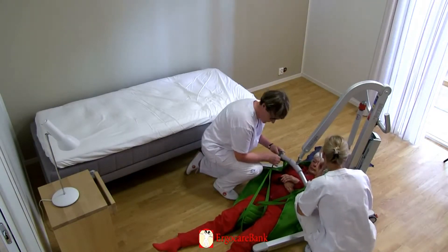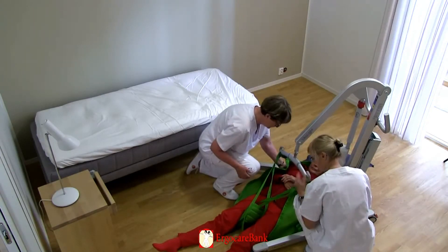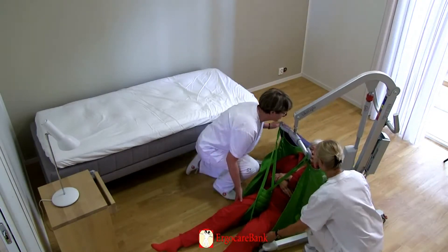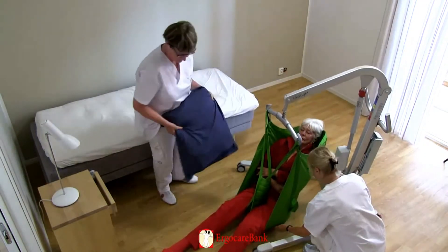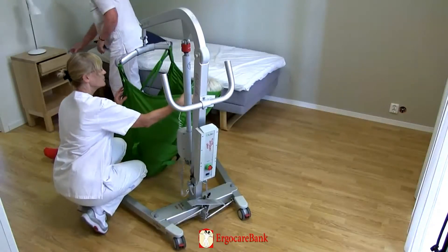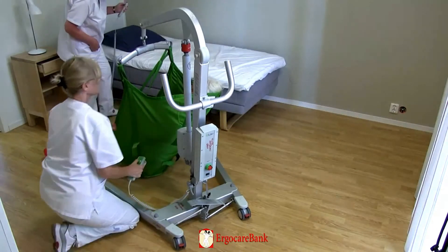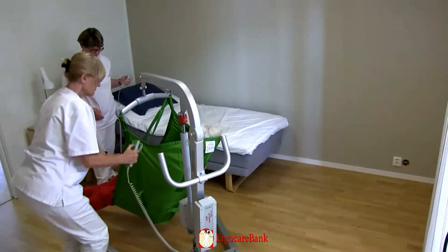The staff control the lifting, and one of them supports Celia's head. As soon as Celia's weight is supported by the lift, the staff stop the lift and check the safety of the procedure. Are the straps properly hooked on? Are the leg straps correctly positioned? And most importantly, is the sling positioned sufficiently low down to reach the coccyx level so that Celia is in a good transfer position?